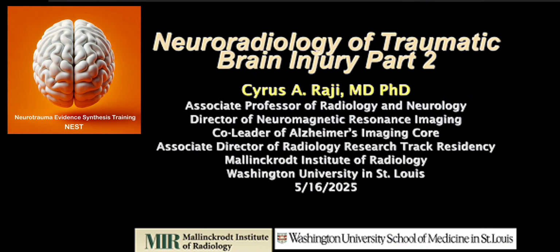One area that you could try to look at on the DTI, for example, is abnormalities in the cortical spinal tract, because the cortical spinal tract will course into that cervical confluence around C1, C2. And if it is damaged on the DTI based on low fractional anisotropy, that could conceivably be correlated to the cervical spine injury as well. There's not a way to track cervical spine blood flow specifically, so that would not be as easy to track. But if you had cortical spinal damage, what you would expect to see is secondary or related cortical dysfunction, which you could then note with the ASL MRI at the same time as well.